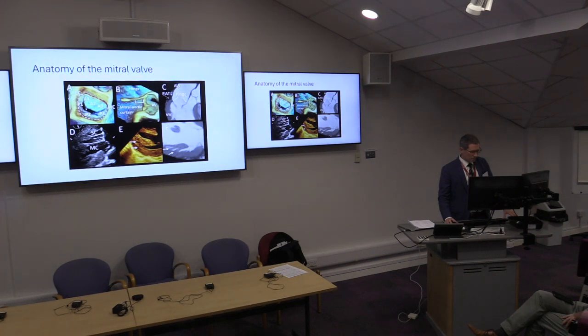One of the points I wanted to make is that this red dotted line, the so-called hinge point, is not at the same level as the aortic valve annulus. That difference, between the area where the mitral valve actually hinges at the true annulus, is known as the mitral aortic curtain. And that's relevant when you come to annular sizing. I talk about whether the annulus is dilated or not, but I know, talking to Mr. Babler, that he doesn't look at my mitral valve annulus dimensions on 3D echo, and you size that in theatre. But we still take pride in looking at mitral valve dimensions.